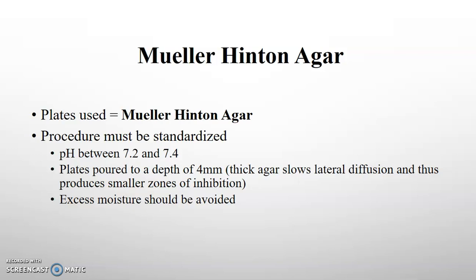So you might give someone a medication and think it's going to work great, and then it doesn't actually work so well. If the agar is too thick, then the medication might not diffuse enough. And what would happen is the test would look less effective. So you might not give someone an antibiotic that could potentially work because of inconsistencies within your results.